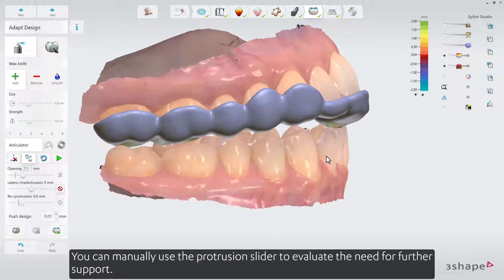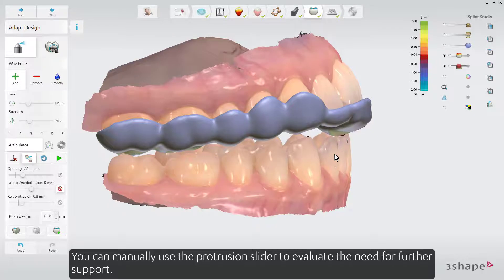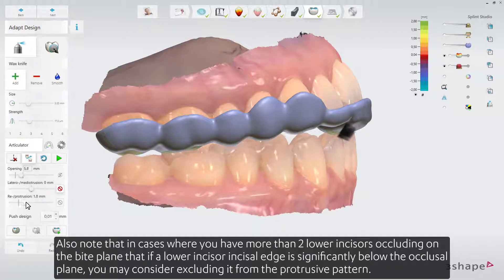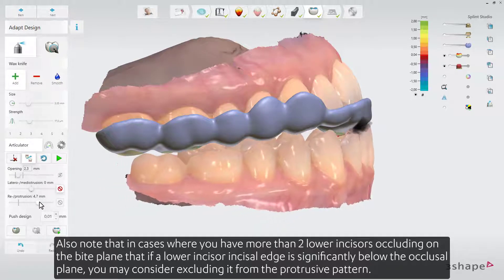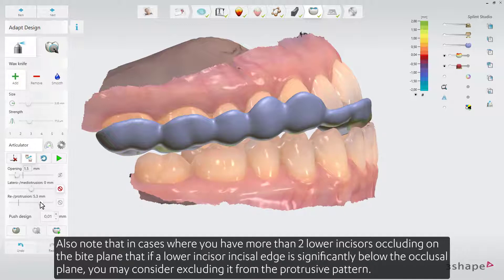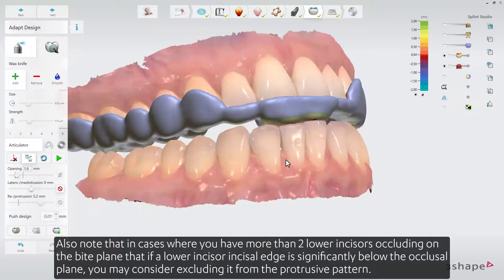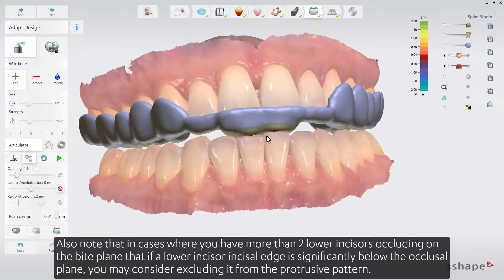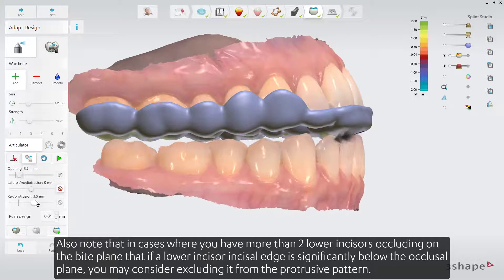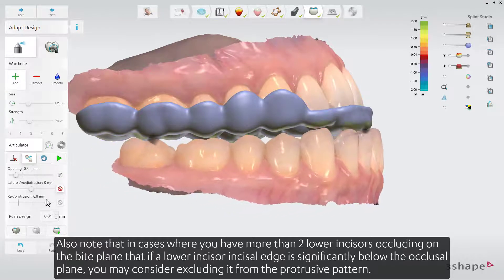You can manually use the protrusion slider to evaluate the need for further support. Note that in cases where more than two lower incisors are occluding on the bite plane, if a lower incisor incisal edge is significantly below the occlusal plane, you may consider excluding it from the protrusive pattern.